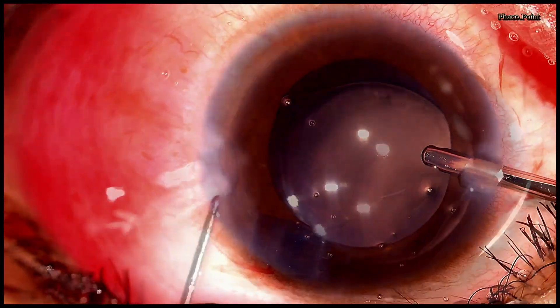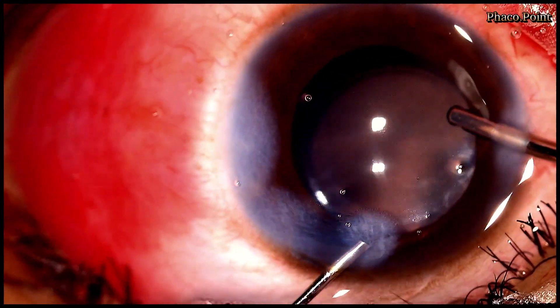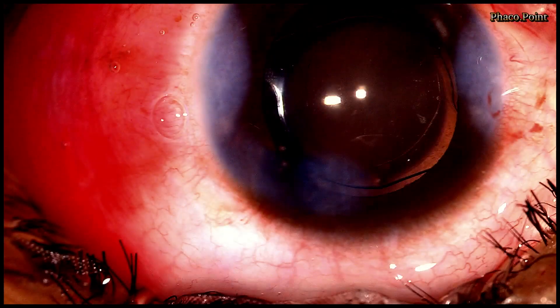Following the completion of the visco wash, all the wounds are hydrated. This then brings us to the end of the first case. Let's now move to examining the second case.